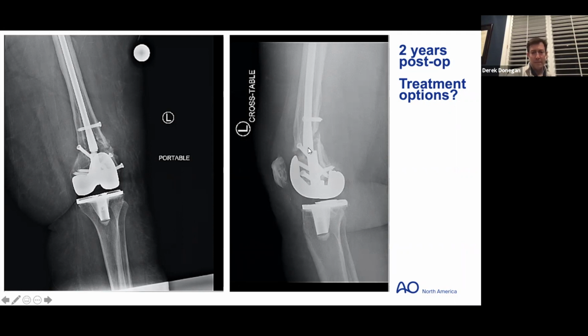One of the things I noticed is that obviously it broke at the interlocking screw, kind of right where the fracture was when the final construct was done. And I don't know if that's a weak spot in the nail, a stress riser on the nail, and maybe doomed to do that. Or it's that typical race. But so what are we thinking now, Matt? What do you do now?